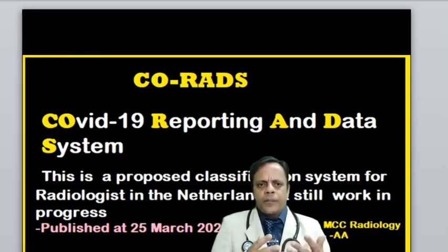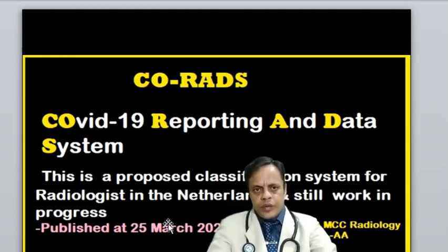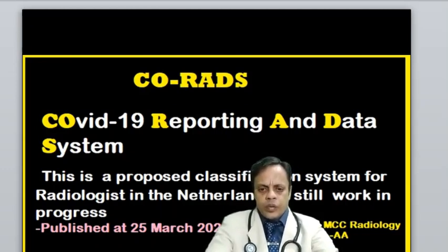It tells us how much is the possibility of COVID pneumonia. It was a proposed classification system for radiologists in the Netherlands, and it is still a work in progress. Day by day some updates are coming, and I will remain in touch with all those updates.